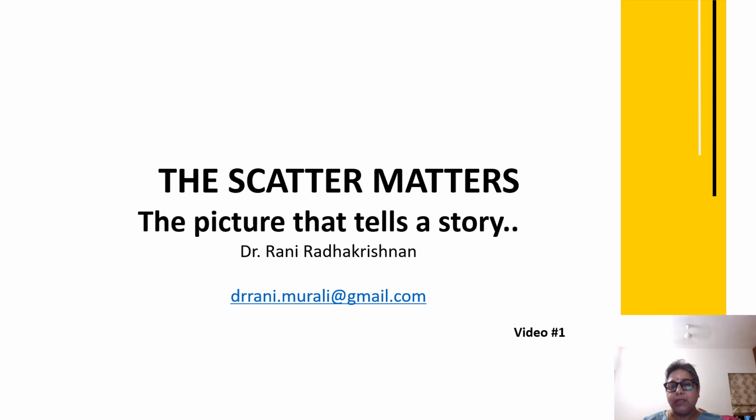The scatter plots, the cytograms, and the histograms are the various pictures that tell us a story. And as we all know, a picture speaks more than 1,000, and in our case, numbers. So let's begin our journey. Let's start learning about these pictures that form a part of cell counters. And as we get to understand them and as we get to enjoy them, we shall also make it a point to use them to interpret our slides and therefore give a better result to our patients.